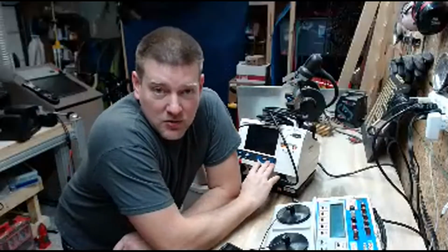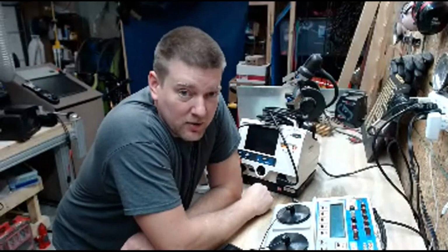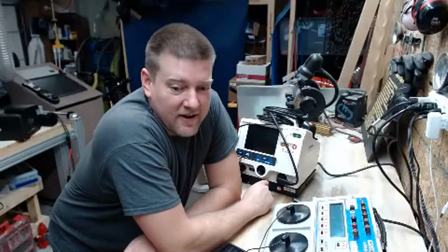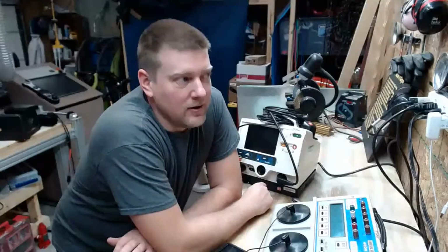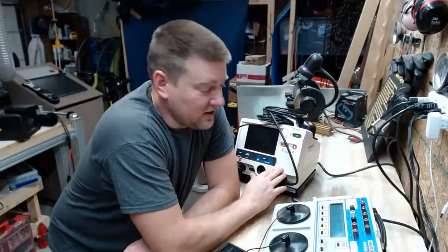Make sure that you set the current date and time in your defibs. It's very important, because later on they're going to want you to pull the report when they have a code. And if the date and time is off and you were the last person to touch that unit, you have some explaining to do. So that's also an item on my checklist.